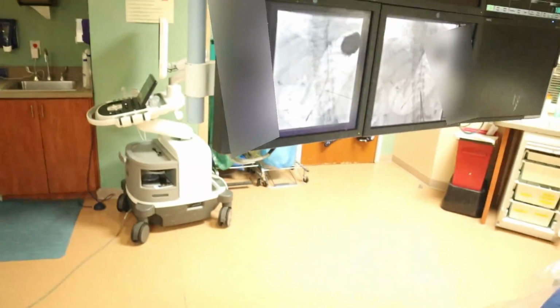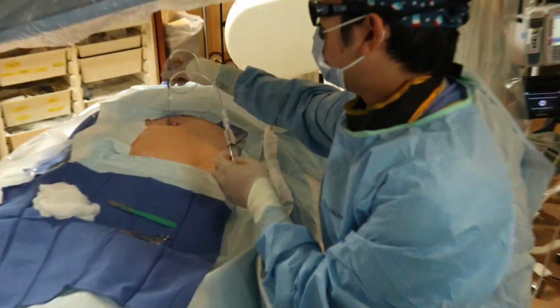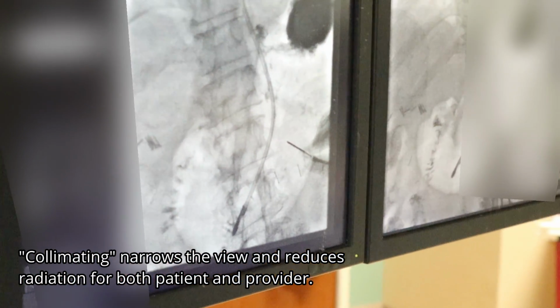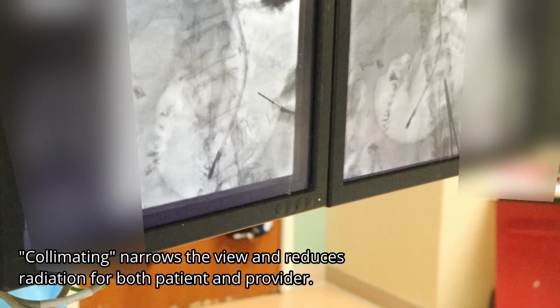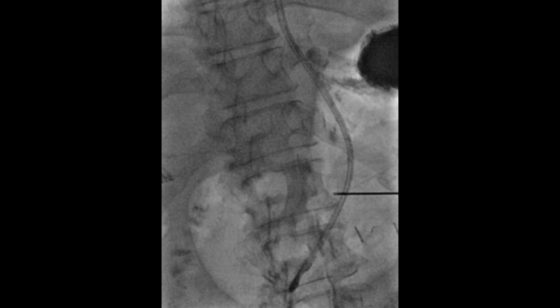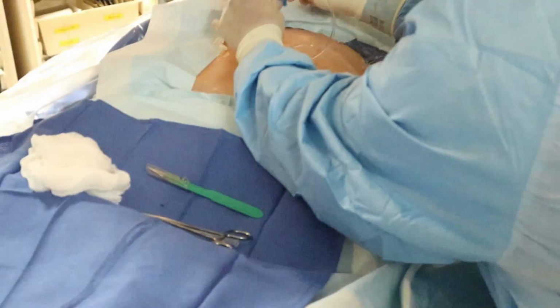Alright, over the stomach, I'm going to go over to RAO 20. Go ahead. That's good. Collimate a little bit, side to side. That's good. Alright, straight down the stomach, puncture, air back. Good contrast. Alright, the stomach, push it in, string off. Test this under fluoro. Okay, so we have a nice 3 T-tacks.